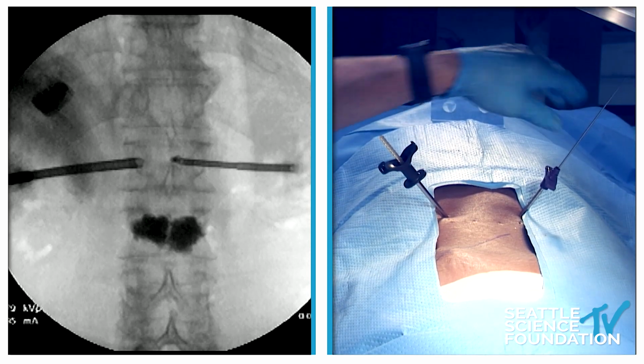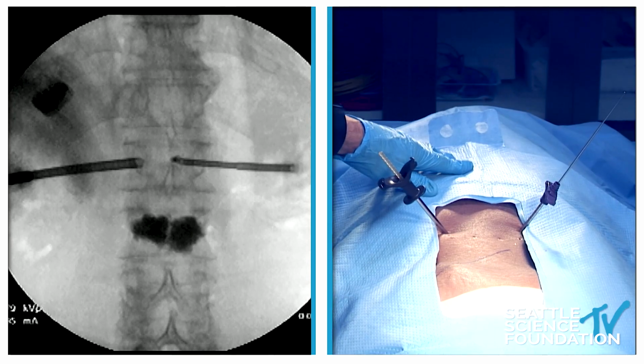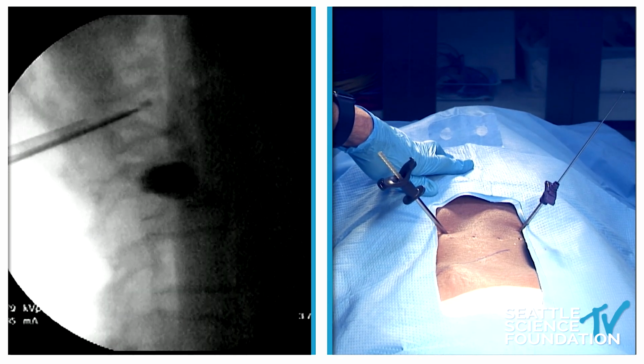So I'll place the K-wire through. I'm going to remove the cannula, same thing on this side. And then we'll go down with the reamer, and then we'll place the implants.